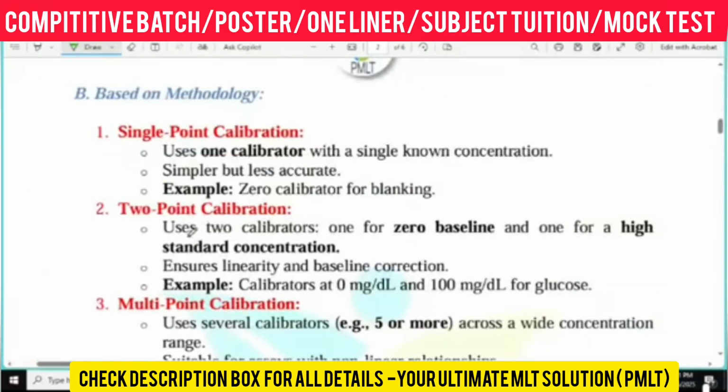See, based on the methodology, it is also important to understand calibration, how it looks, as well as which things are going on in this particular method. First one is single point calibration. Here it uses one calibrator with a single known concentration. Getting my point?